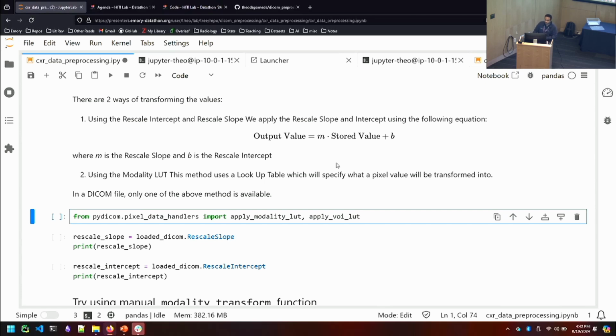Imaging modality, so you have CT scans, you have MRIs, you have ultrasound. Those are different modalities. Different types of cameras, like a Nokia phone, Android, iPhones.